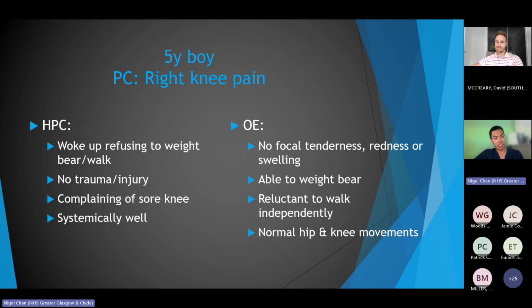And it's a good question. You can't tell just by looking at ultrasound, but you're not using the ultrasound in isolation. You're using it with the assessment of your patient and how they look. And actually that kid looked well, didn't have a fever, obs were fine. So clinically, they didn't look like they had a septic joint.